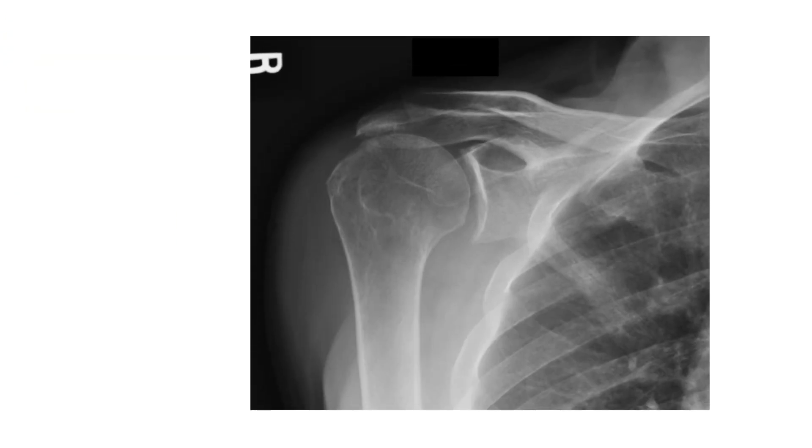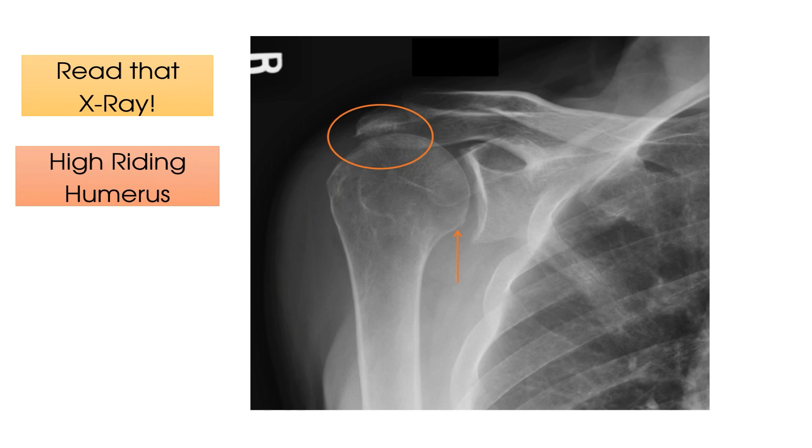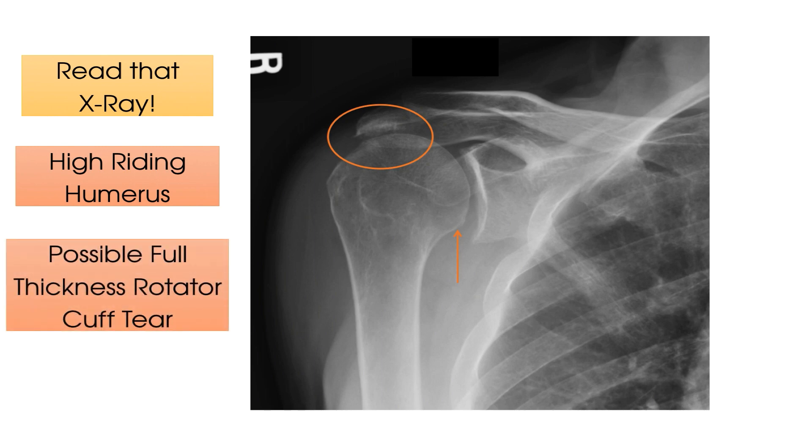Here is X-ray number three. Read that X-ray. Time's up. In this X-ray, there is no sign of bony injury. However, we can see that the humeral head is sitting very high in relation to the glenohumeral socket. Look how close the humeral head sits in relation to the acromion — a significant reduction in the subacromial space. This is often referred to as a high-riding humerus and commonly occurs when you have a patient with a full thickness rotator cuff tear. You may expect your patient to have an element of subacromial impingement as well, due to the reduction in the subacromial space.